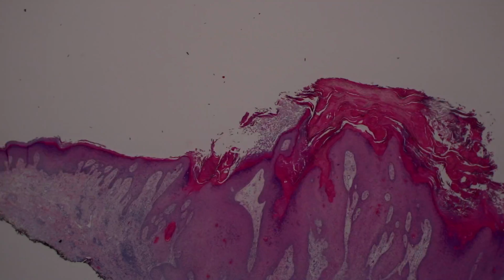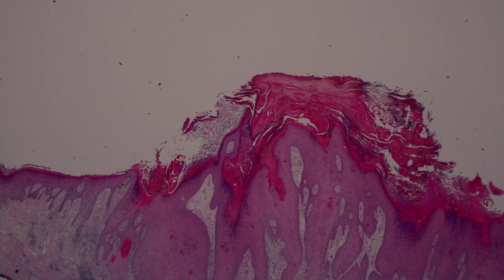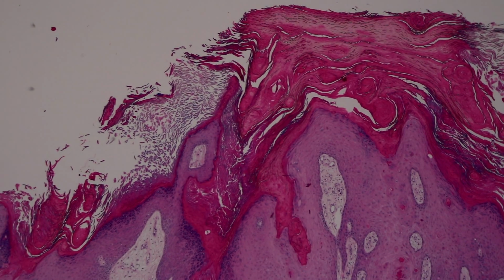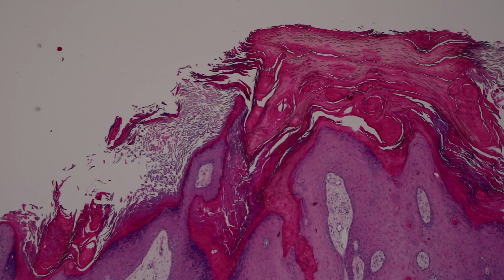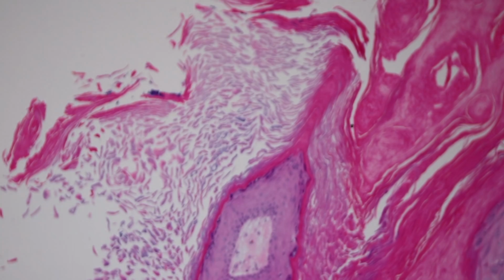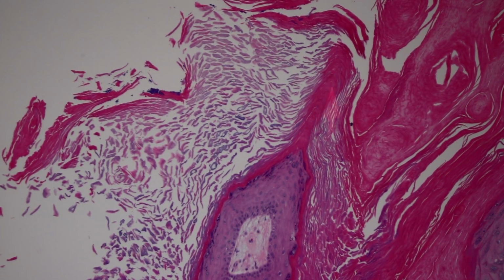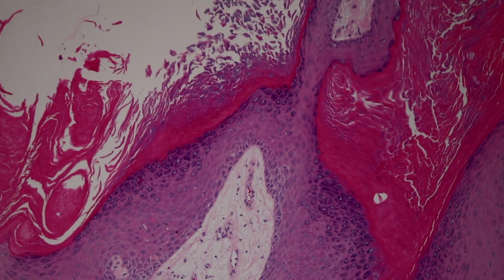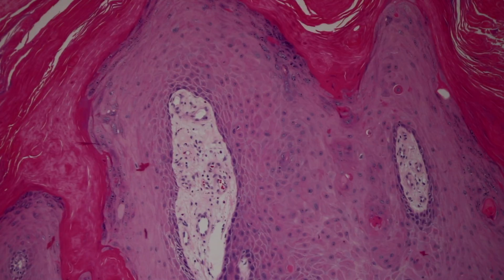And then here's more examples along the same lines. If you had the top of this, you could think about a prurigo nodularis, or you might even think about a verruca, a wart. It's got some papillomatosis, some finger-shaped projections. It's got parakeratosis in spires, like right here. A nice spire of dense keratin with some para, and then also some loose ortho around it. You've got dilated vessels in the papillary dermis. So all of these are good features for a verruca vulgaris, a wart.